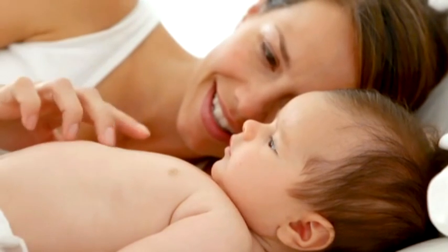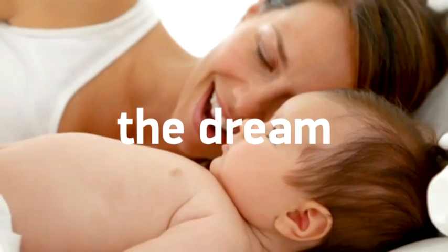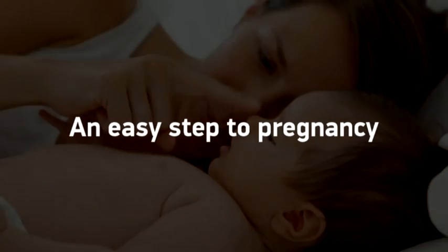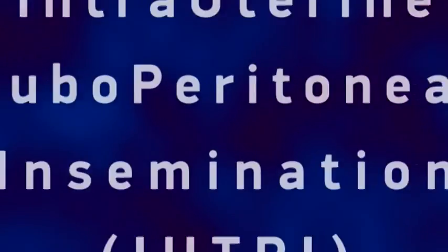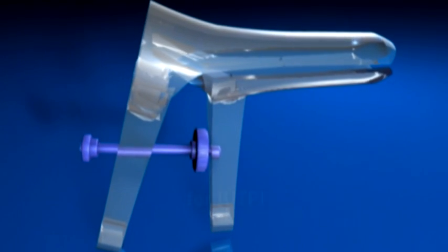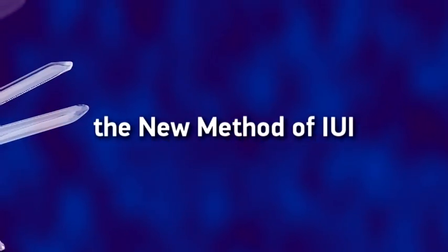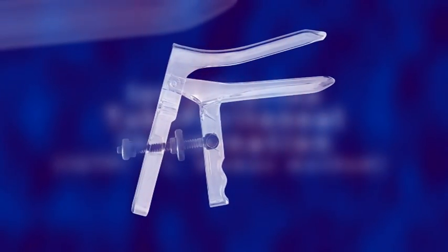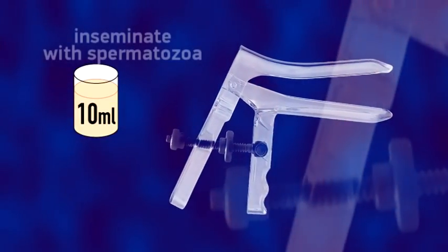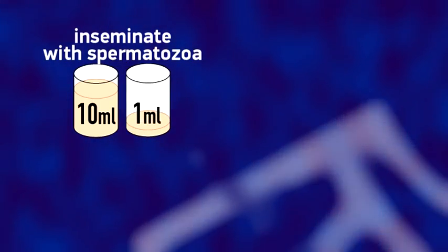A baby, the dream of thousands of women around the world — an easy step to pregnancy. Double Nut Bivalve DNB Cervical Clamp for IUTPI, the new method of IUI. Intrauterine Tuboperitoneal Insemination, IUTPI Elmamas method, is a new method of insemination with 10 ml of inseminate, compared to standard IUI with 0.5 to 1 ml.